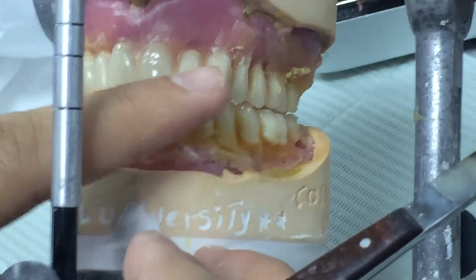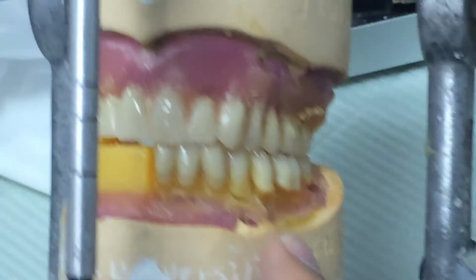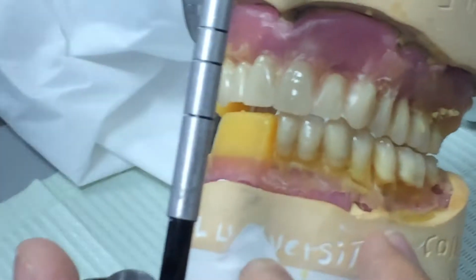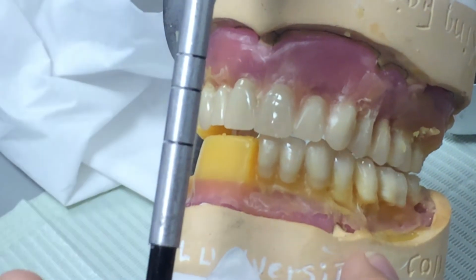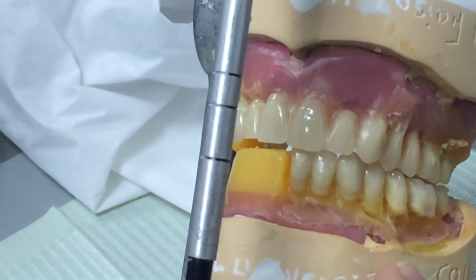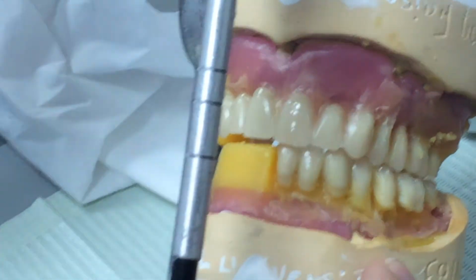Notice that we have done the upper anterior. For you guys, you have to start with upper anterior, then lower anterior. The 6 front upper and 6 front lower. Then you go for posterior teeth. Okay? You should not proceed. Let's say you finish upper anterior, somebody has to tell you that you have to go to the posterior, lower anterior.